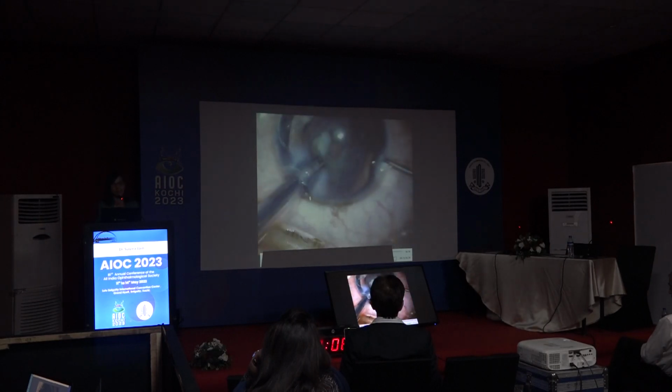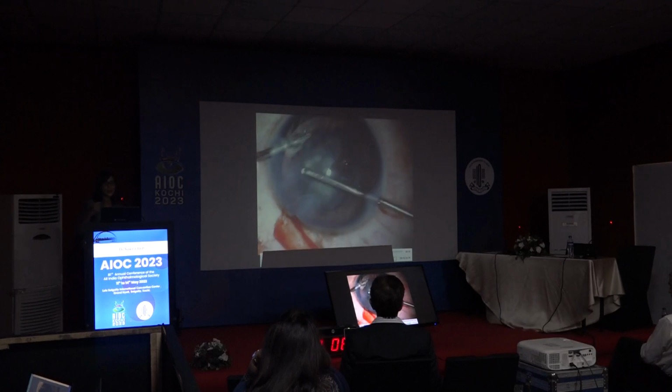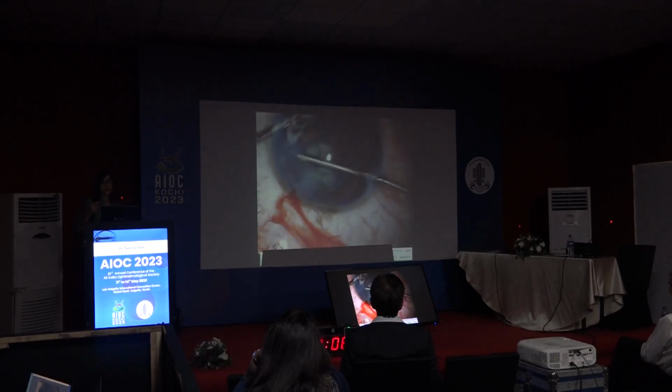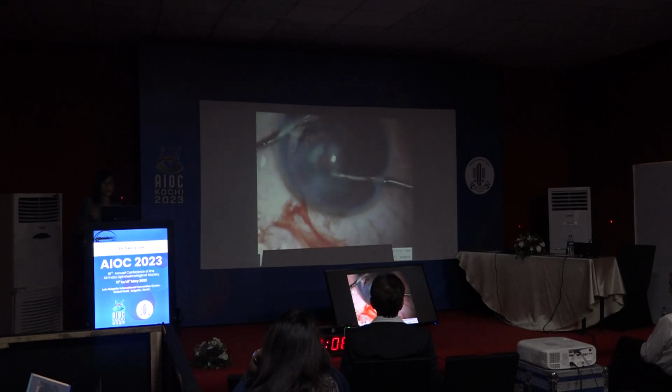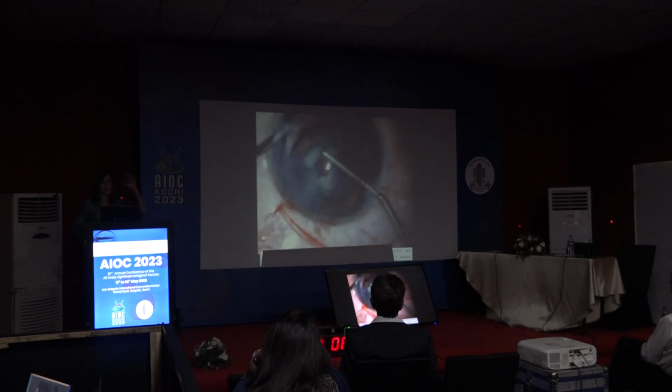I haven't aspirated anything. So without bringing the probe out of the eye, I do a viscofluid exchange. And I just try to remove a bit of the cortex with IA because there's no vitreous disturbance according to me. But that didn't seem to work. I got very little bit of it out. And then, of course, there was some vitreous disturbance.